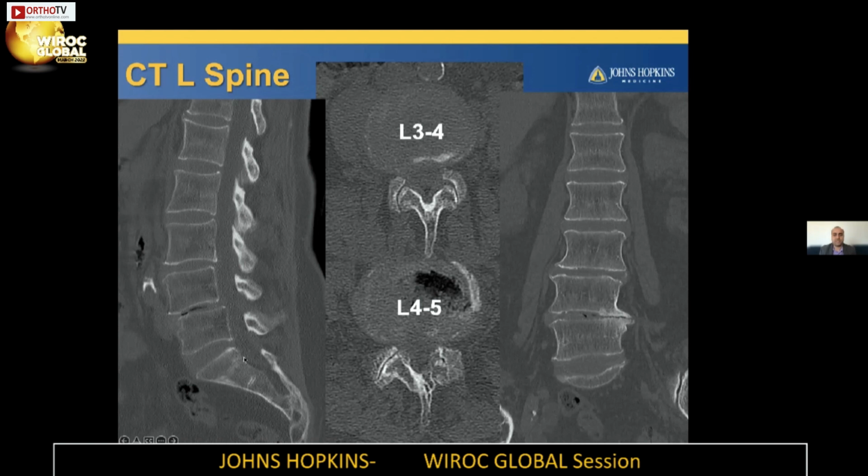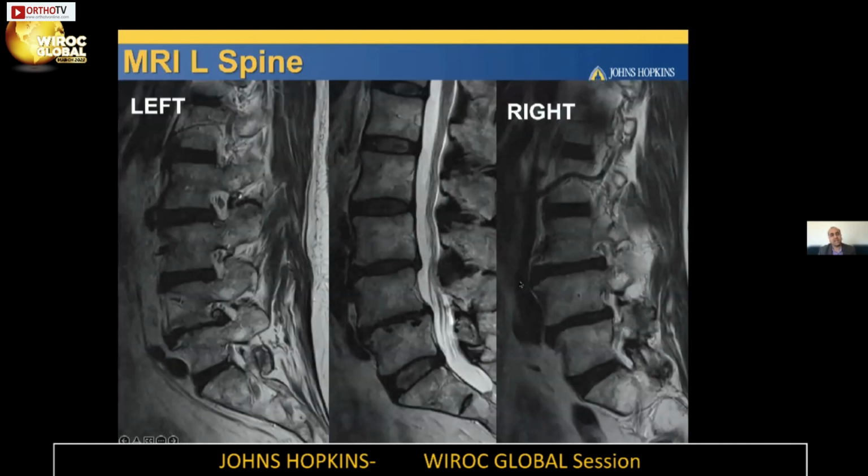So at L4-5, grade 1 spondy with a vacuum air sign. At L4-5, you can see the degenerative changes in the facets, and then L3-4. Interestingly enough, I always like to look at the coronal pictures on the CAT scans because I find them very helpful. In this scenario they showcase asymmetric disc collapse at L4-5 with osteophyte formation, as well as a little bit of a lateral listhesis at L3-4. That to me is pathognomonic for the pain generator. So it's really, really important to look at that.